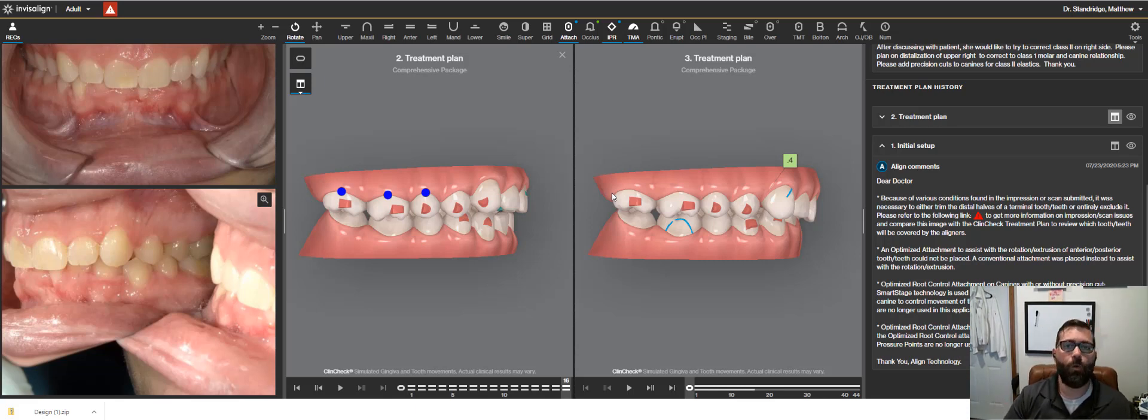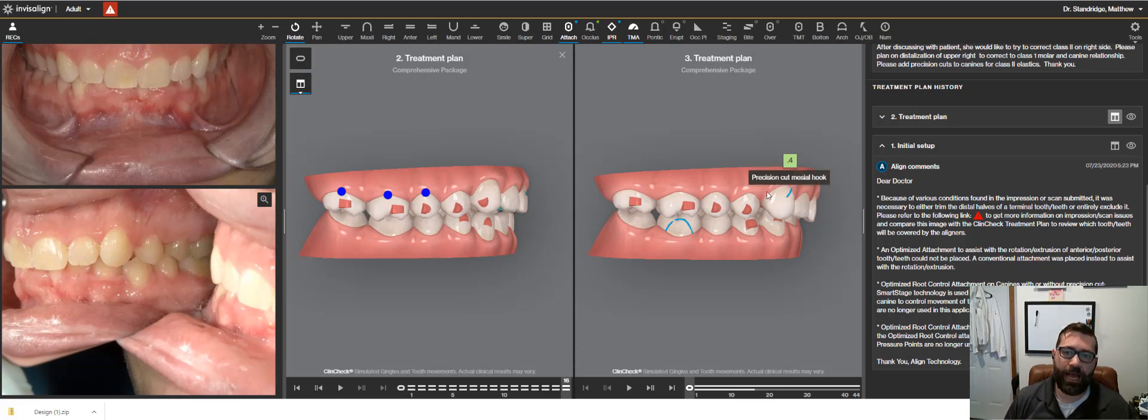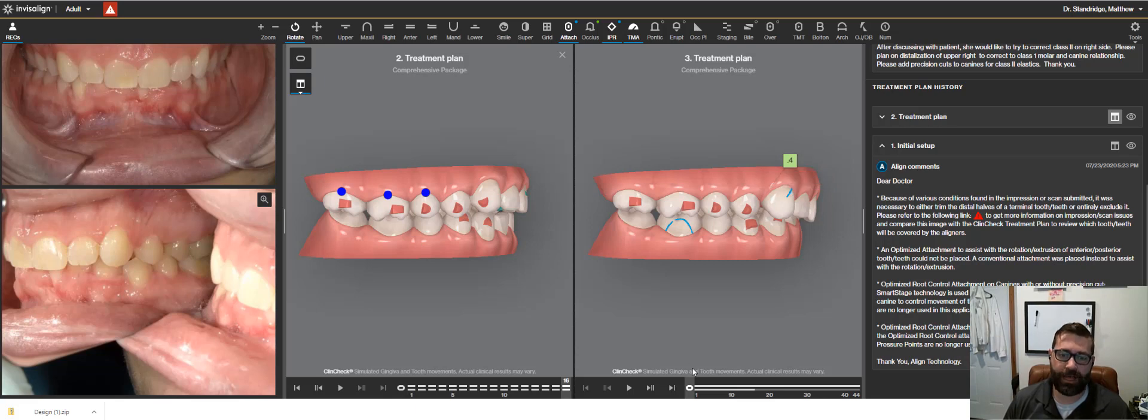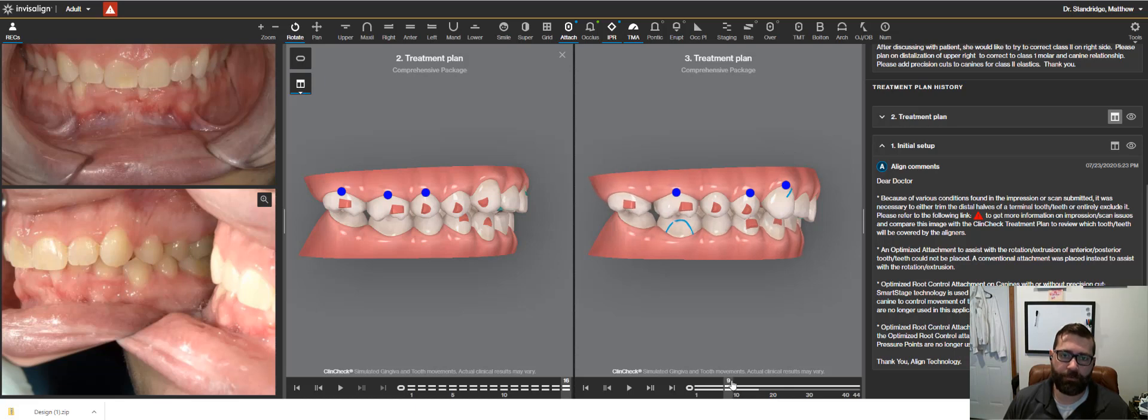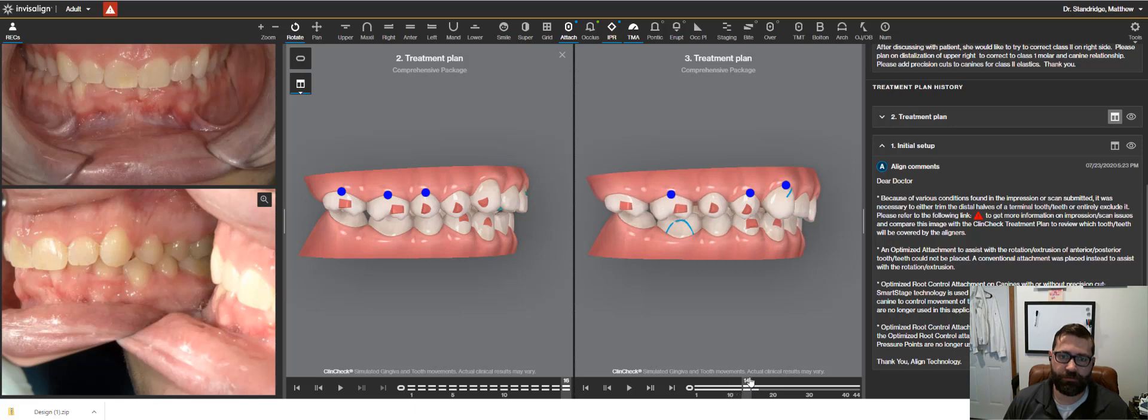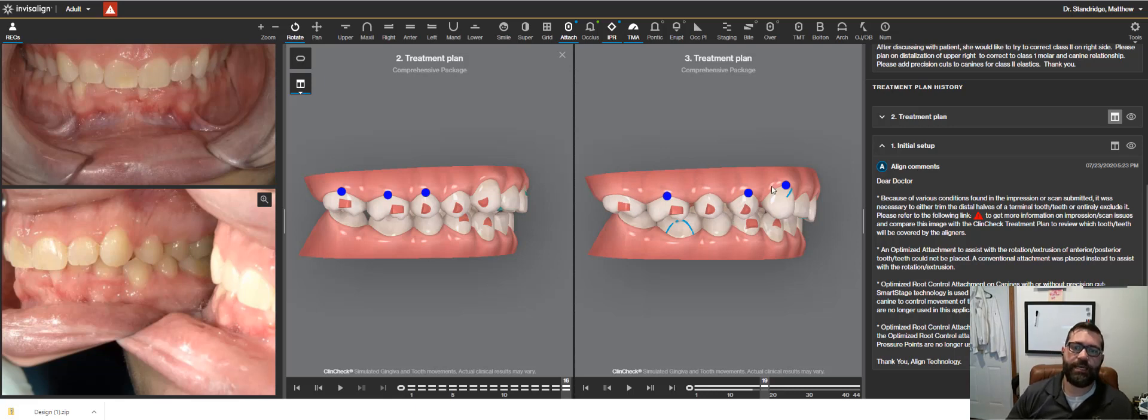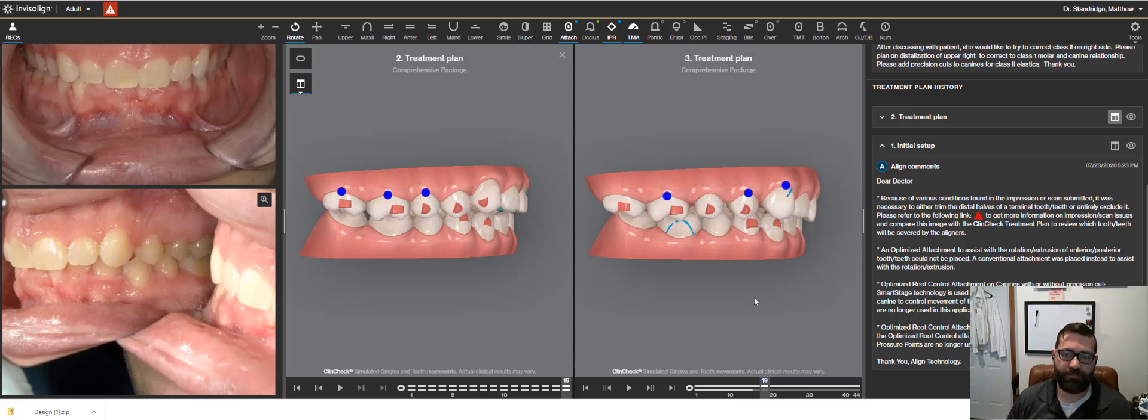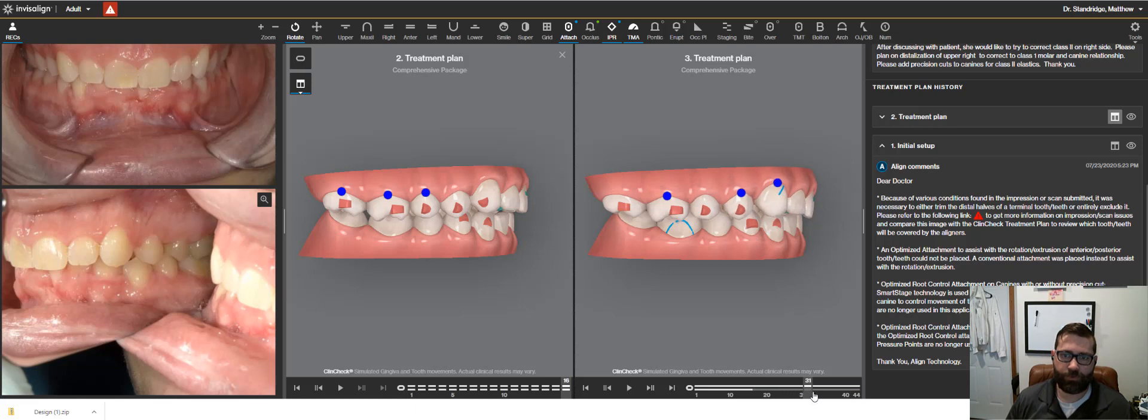Also, we want to increase the anchorage on that side. So that's why we have cutouts for a button here and cutout for a precision cut for a hook for a class two elastic to go. So you're going to see I'm not doing a whole lot on that upper right now because I'm focusing on molar position, right? And I'm using this class two elastic to keep from any unwanted anterior movement. It's to help redirect that force so this stuff just goes distal. And that's where we're projected to go.